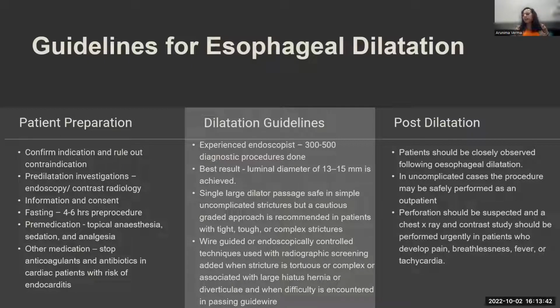Post-dilatation, after dilatation, the procedure is not over, because you need to follow these patients closely, because these patients may have complications like perforation, bleeding, which may need hospitalization. Uncomplicated cases can be performed as an outpatient procedure.